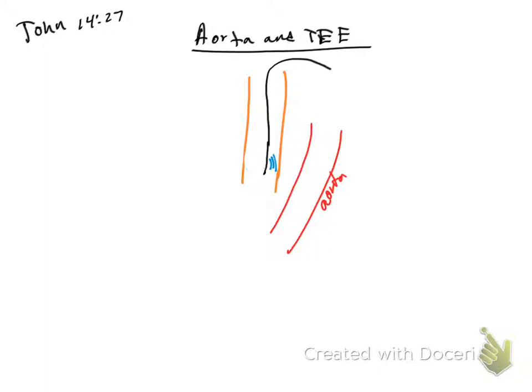But why would I like to visualize the aorta? Well, probably if the patient has an aneurysm, you can detect it, and other things. But aneurysm is one example, and I would like to explain better because the aorta has 4 divisions.